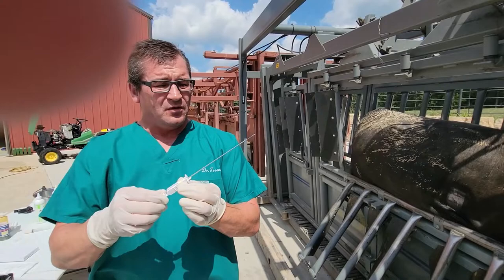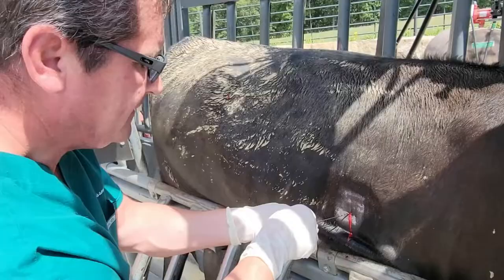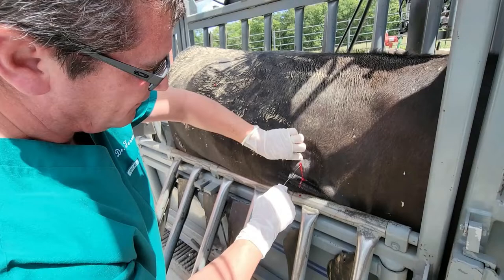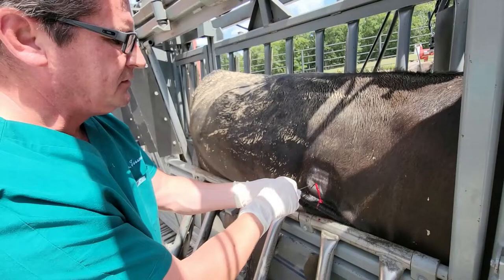Hold that steady and then advance the sleeve portion, and hopefully we'll have a very good sample. We want to push and aim forward toward the opposite shoulder, just like in the traditional descriptions. However, we don't have to be at such an acute angle down or forward — we can pretty much just go straight forward.